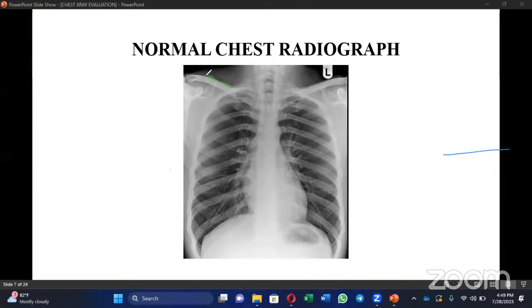You see where I'm drawing? That green line, those are the cortices. When you see discontinuity, there was a free flow whilst I was drawing along the line. So when you see that there is a breakage or a discontinuity, then you should call for further evaluation, and you should say that yes, that part is fractured.